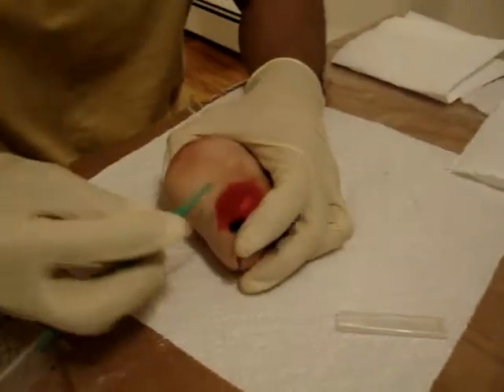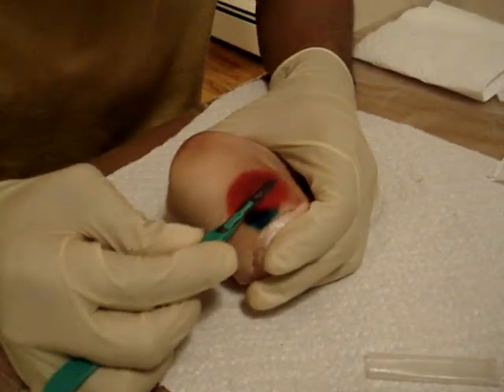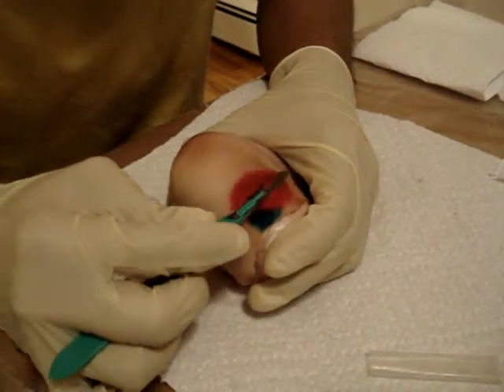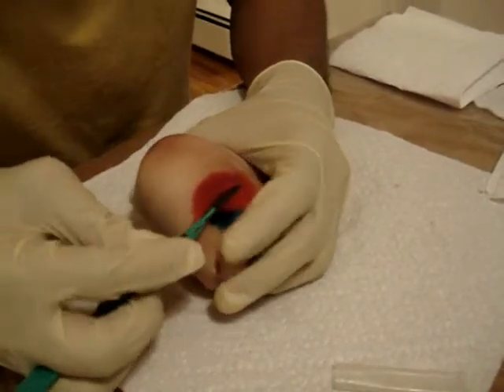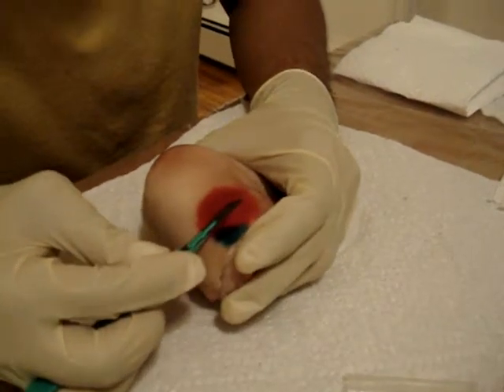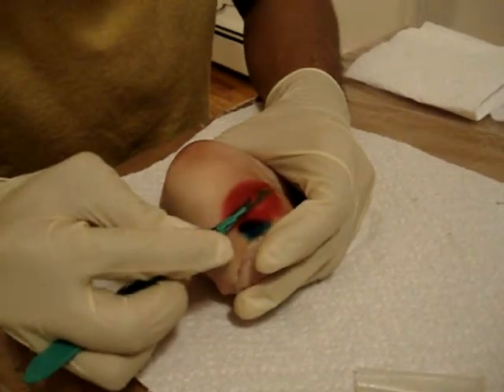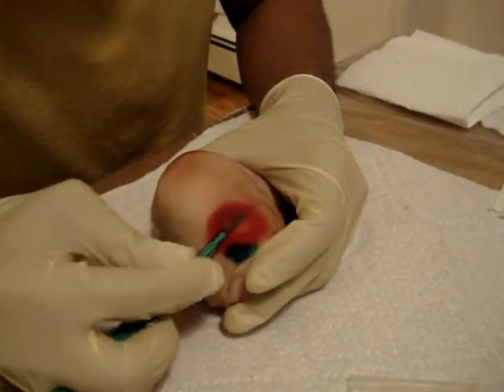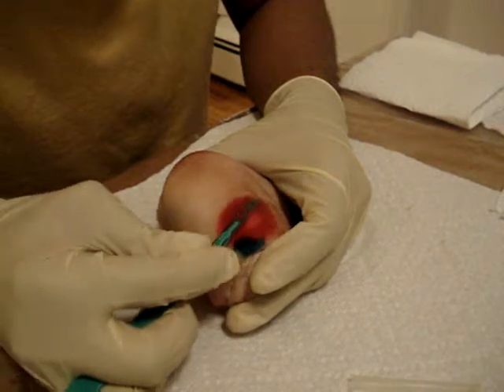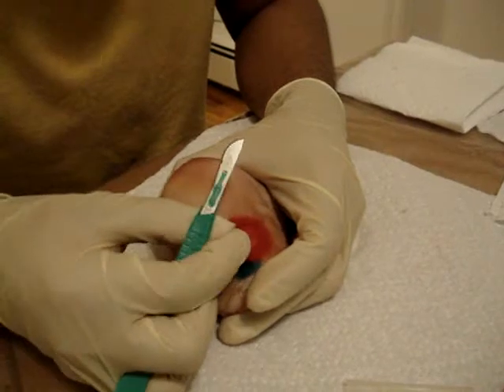Now, we are going to just continue shaving until we are able to gather a good amount of callus here, and one more here in this area, making sure that the forearms are rested and the blade is now parallel on the skin. There you go. Now we are going to keep on doing this until we have decided that it is time to stop, because we have reached that viable tissue area.